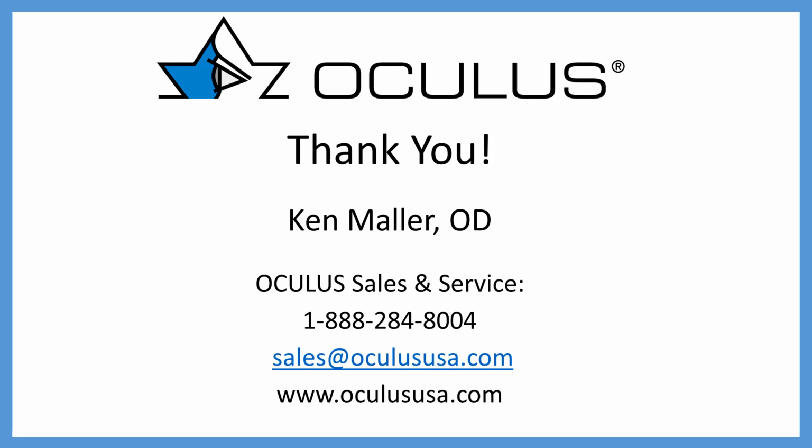So that worked very well. If I have absolutely no data whatsoever, because these lenses are fitting so well, I actually have contemplated putting a trial lens on so that I can get some over-refractive data so I can have a better power idea for my first lens. And the reason I say it that way is because I've been fitting empirically now.